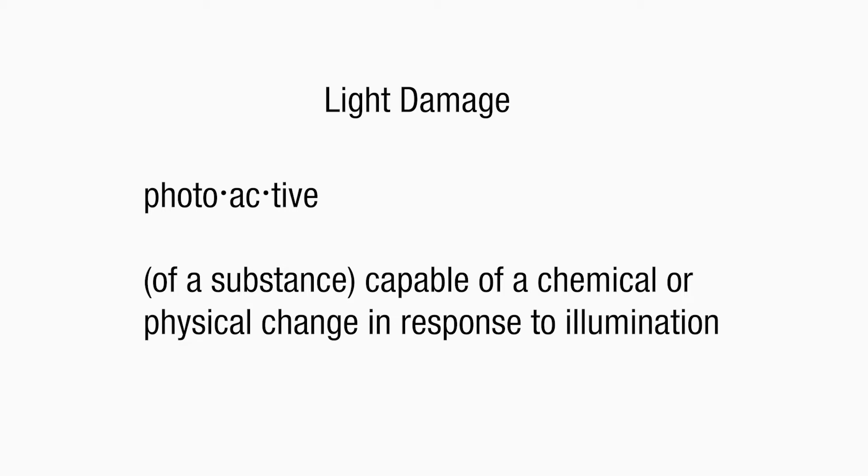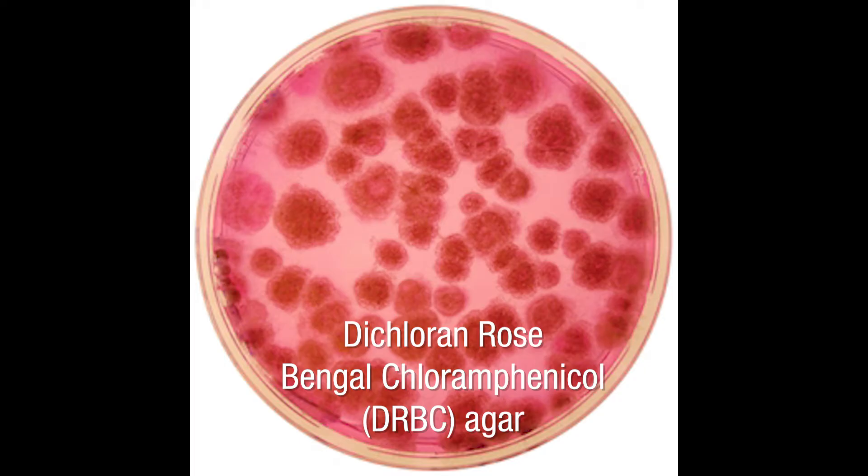Light damage is also common due to photoactive compounds. These are substances capable of a chemical or physical change in response to illumination. This is something that is commonly found in dichloran rose bengal chloramphenicol agar.